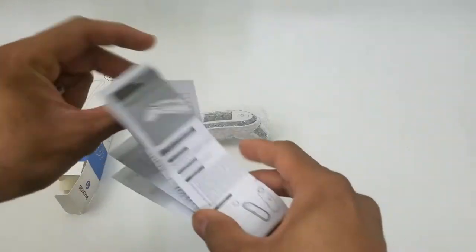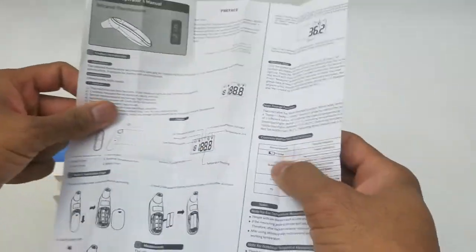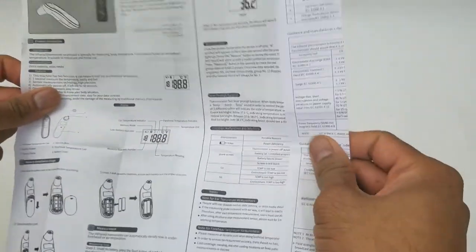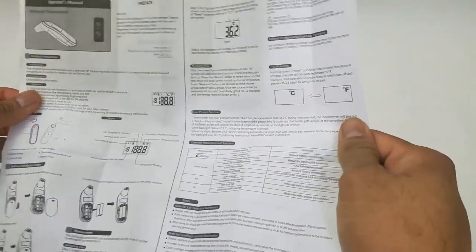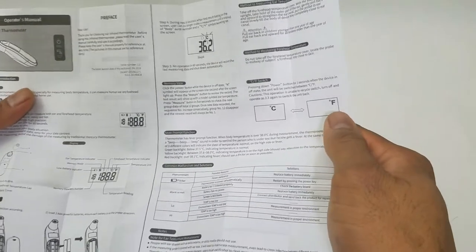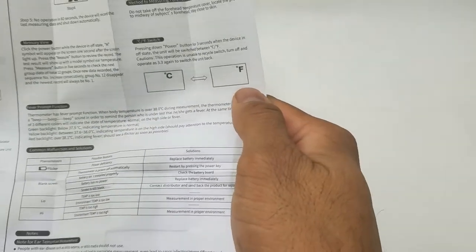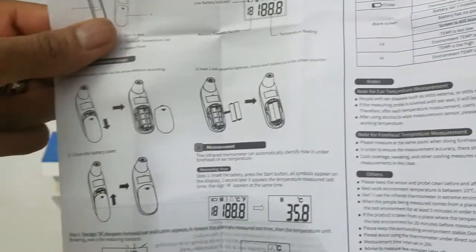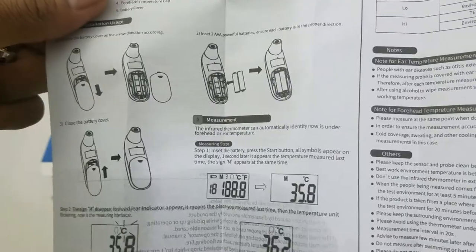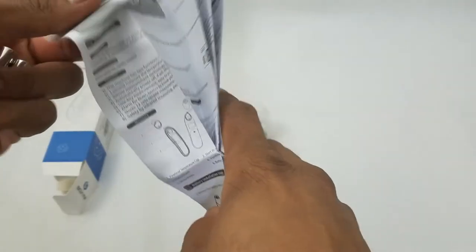This is the instruction manual, very detailed and a pretty lengthy read. It can switch between Celsius and Fahrenheit. It does take two AA batteries—everybody has those around the house. Just check the back of your remote.